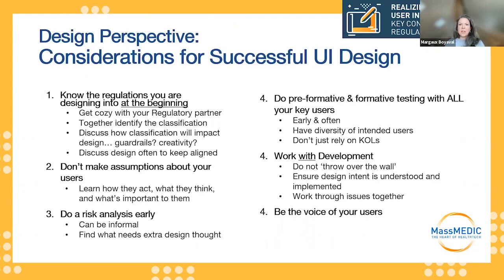My background is in design, and I thought from a design perspective, really when you start out to design a successful UI design, what are some things that will help you along the way? So I've got actually here 6 tips on how to do that.